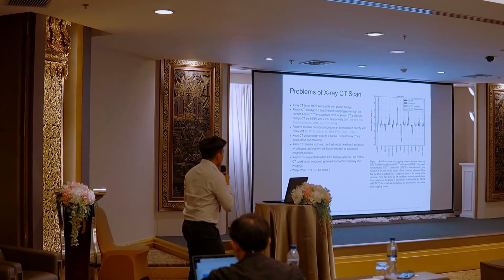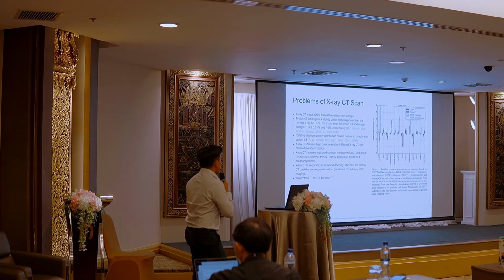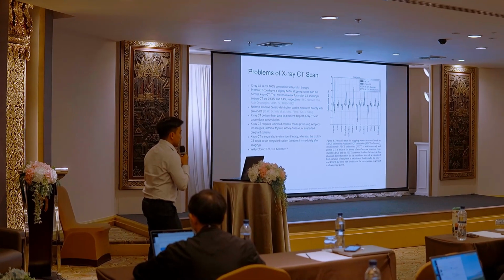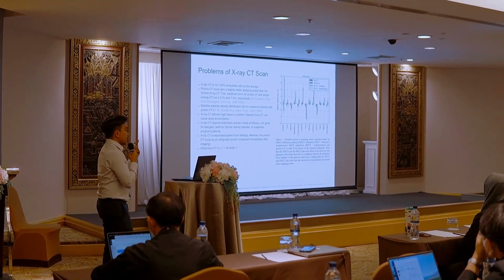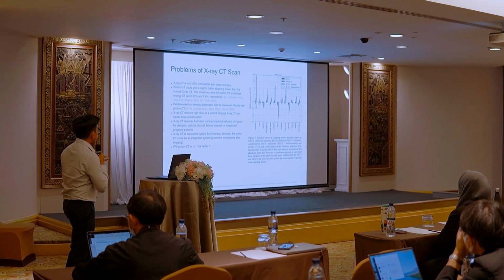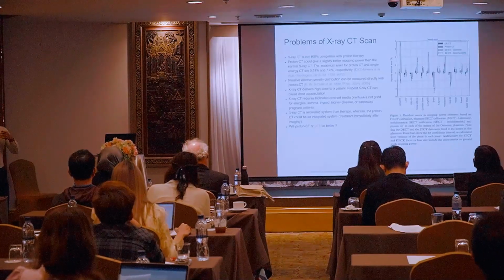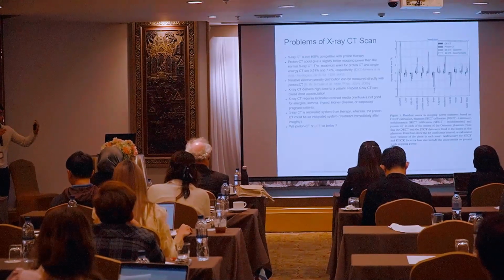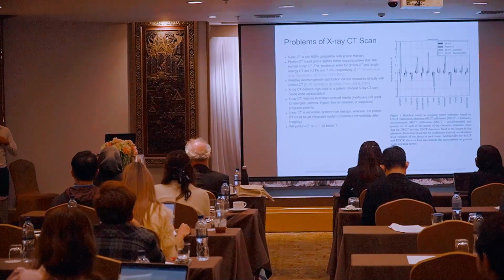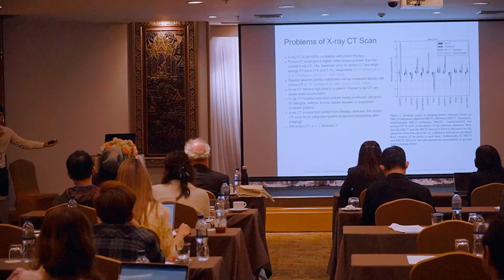If you have the proton CT, it is more compatible with the proton therapy, with lower uncertainty. This is the first good thing about the proton CT scan. The second thing is, when you do the X-ray CT, the doctor cannot repeat the X-ray CT that often, because the patient will accumulate a higher dose, right? More than the limit. This means the doctor has to wait for a while and then do the CT scan again.